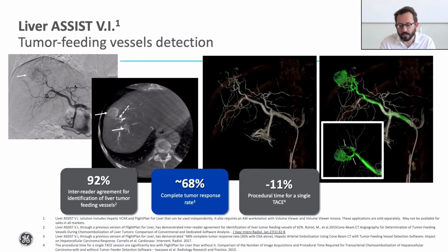And when you apply that in routine, you may also have, which is something interesting, more confidence, I told you, probably less contrast injection because you don't need to inject all the time. You have the 3D images with you. Probably less deposition and less duration.